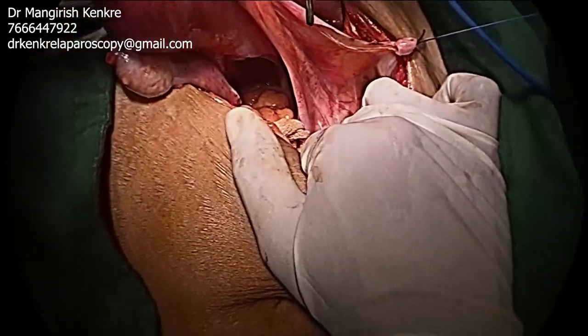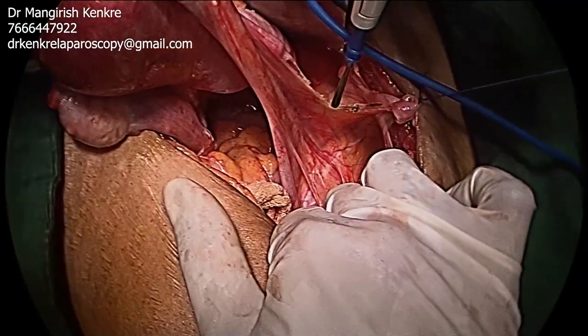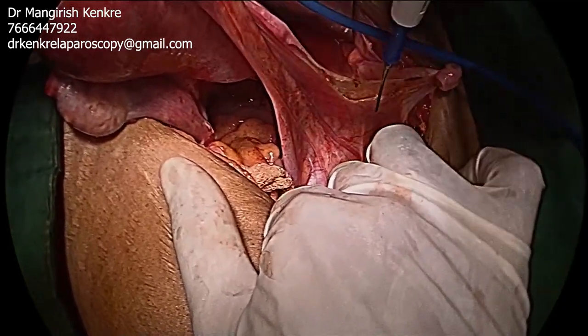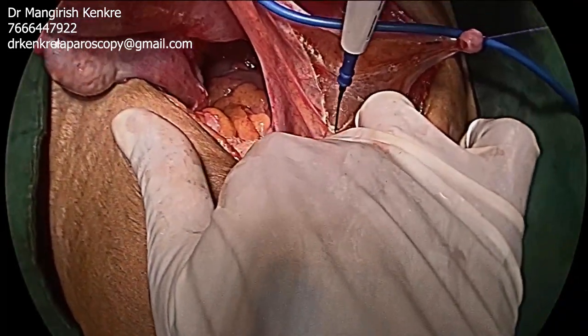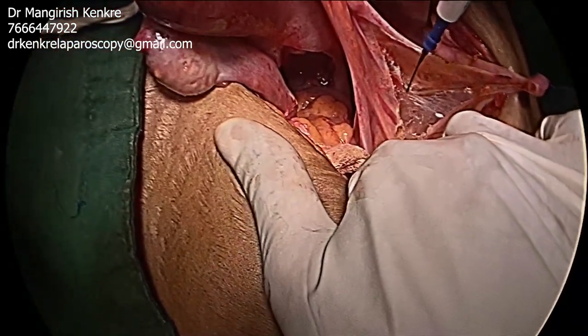The peritoneum is then cut to expose the two leaves of the broad ligament. The incision is extended in a cephalic direction so as to make adequate room for dissection. At all times the uterus must be placed under traction by the assistant.